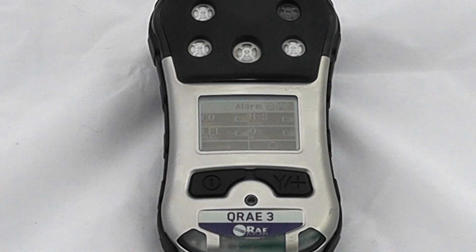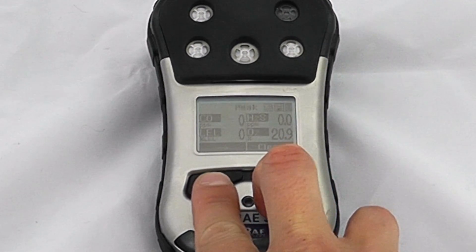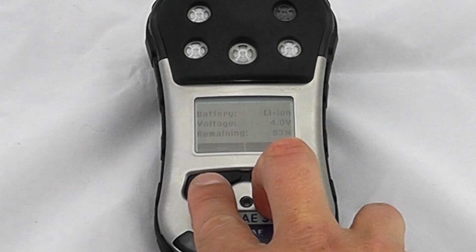It works in a very similar way to any other Ray instrument. While we're having a look at this particular setting we can scroll through some of the peaks, minimums, STELs, TWAs, and time and date stamp.